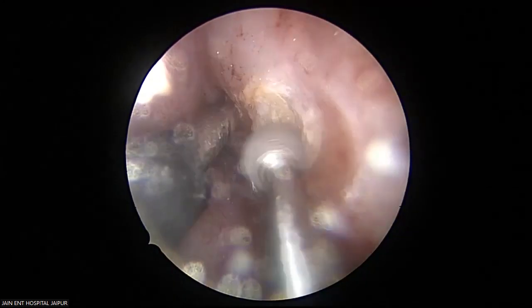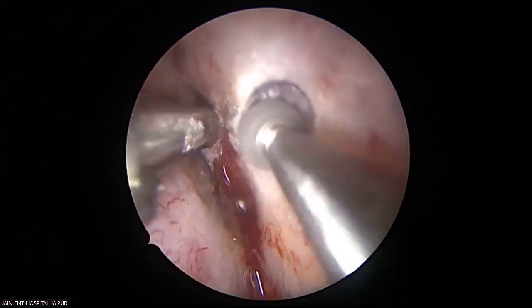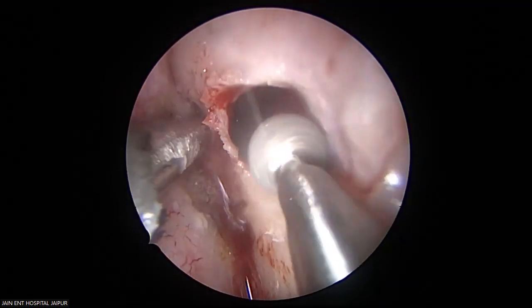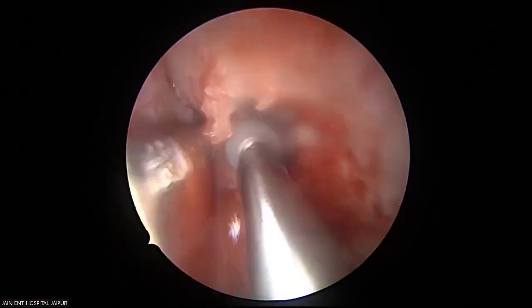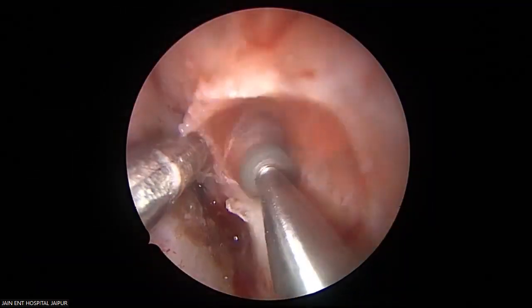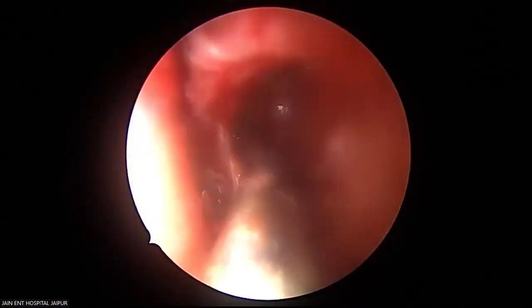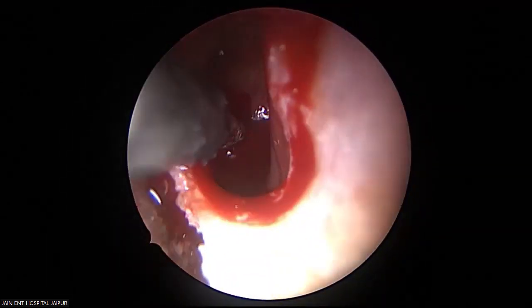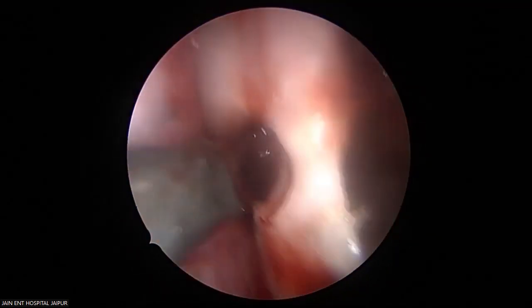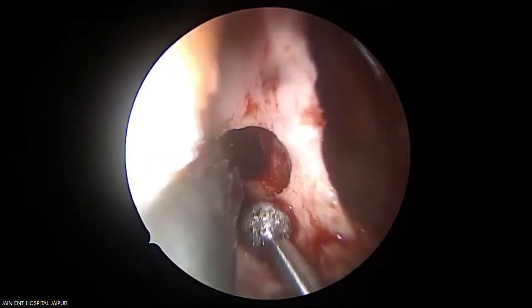The most important structure coming in the lateral wall is the nasolacrimal system, which we have to deal with to prevent future epiphora. See, that's the entry into the maxillary sinus. Right, sir. Section. That's the interior of the maxillary sinus, you can see. A tumor bulges behind in the posterior wall. You can see that. So now you have to widen this more and more.